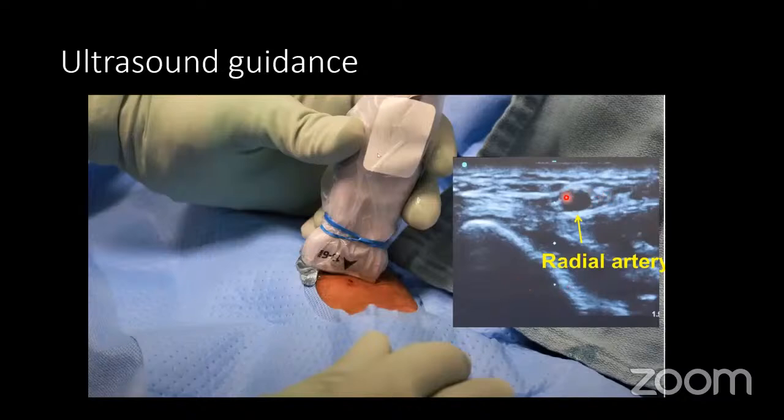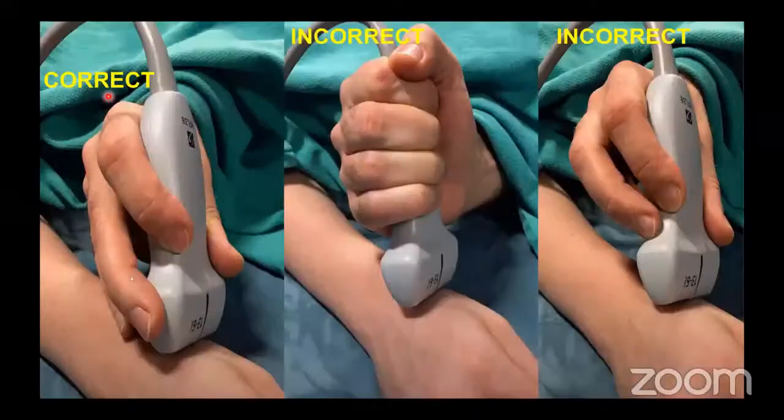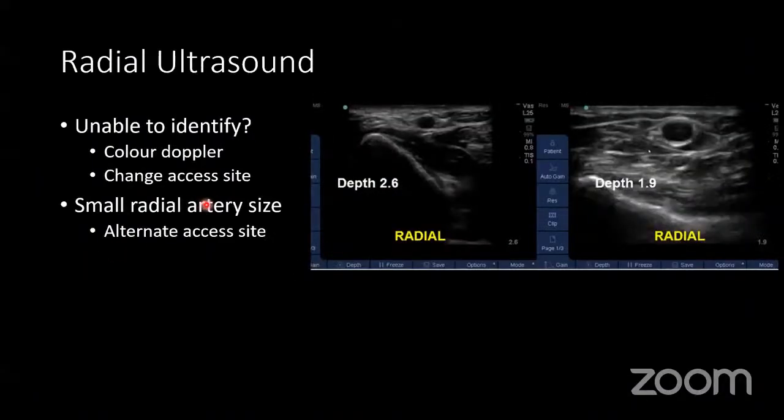Here we can see the radial artery. It is round and less collapsible when compared to the veins, and this should be the correct method to hold the ultrasound probe. And we can see the depth, we can see the size, and we can confirm whether it is an artery by checking the color Doppler.